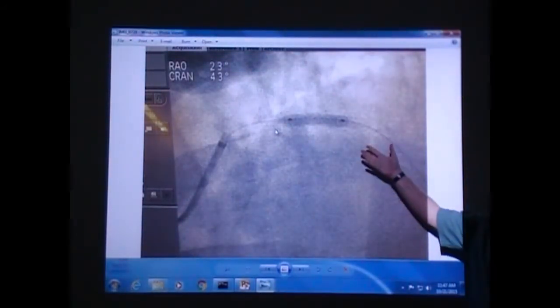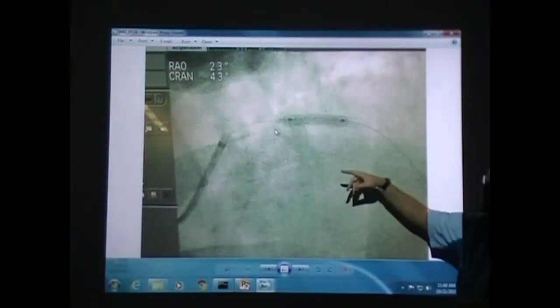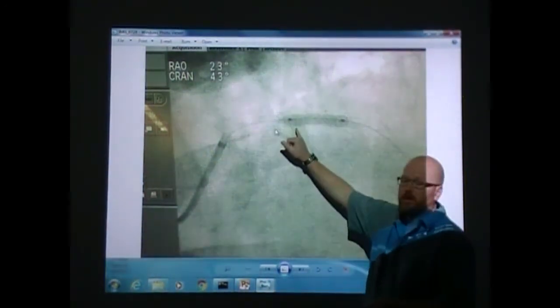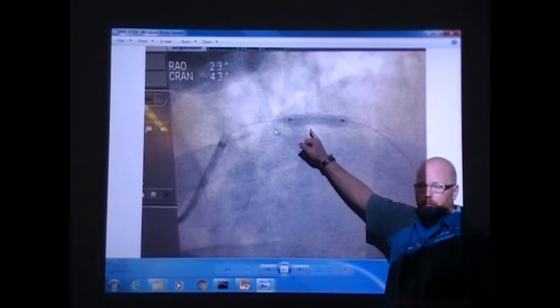But we'll go dilate it, and then we'll go in, and based on our catheter size here, because we know this is a known diameter, we can measure the vessel, figure out what size stent we want to put in. And all a stent is literally, if you think of a mesh and a long tube, we can do, on the right, like 38 millimeters long, which doesn't seem very long, but when it's in there, we're doing the vast majority of the right. So we'll figure out how long the lesion is and how much we need to take down.